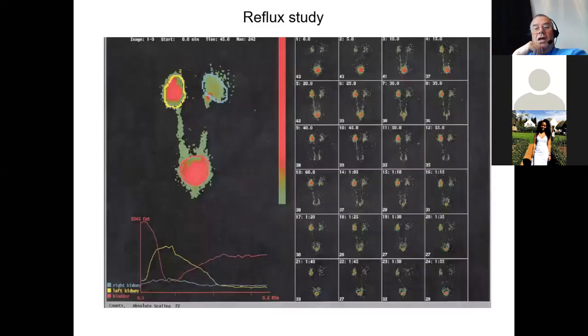of an issue. So here we have a reflux study, and what we've done is that the patient had a renogram, the activity in the bladder. We now get the patient to sit up, and if we can, we sit them with their back against the gamma camera, and we ask them to void into a commode, which we set up by the gamma camera. It's very difficult to pee when you're lying down, and it's even more difficult to put a commode. So we tend to do it sitting, which is a little bit artificial, because we believe that most reflux that causes pathology occurs at night when the patient's lying flat.